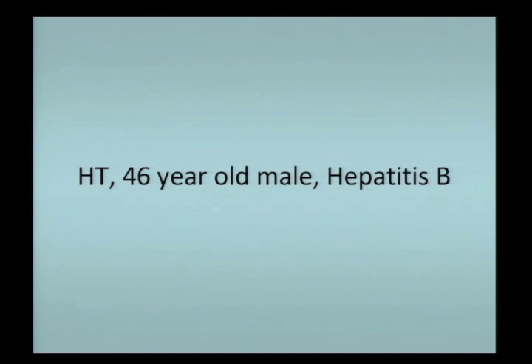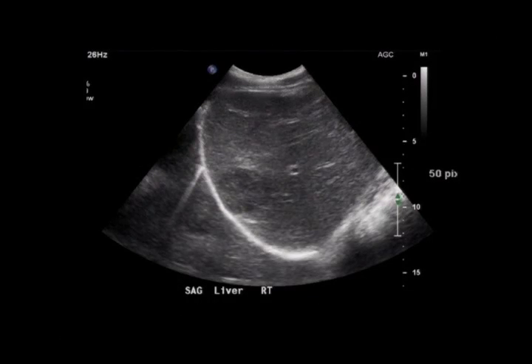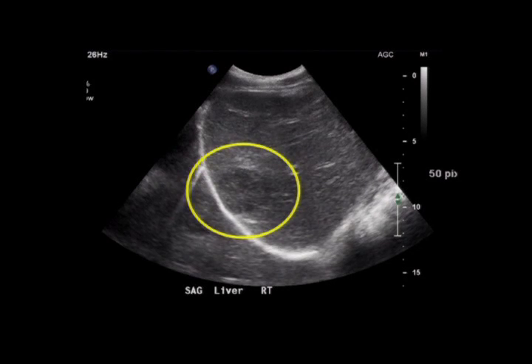We'll focus on two cancers as model systems to discuss imaging in cancer care: hepatocellular carcinoma and colorectal carcinoma, starting each with a clinical vignette. The first topic is hepatocellular carcinoma, beginning with patient HT, a 46-year-old male with hepatitis B undergoing ultrasound screening for cancer detection. On this screening ultrasound, we've detected a suspicious-looking area in the liver that appears slightly darker than the surrounding normal liver parenchyma—a highly suspicious finding in a patient with hepatitis B.